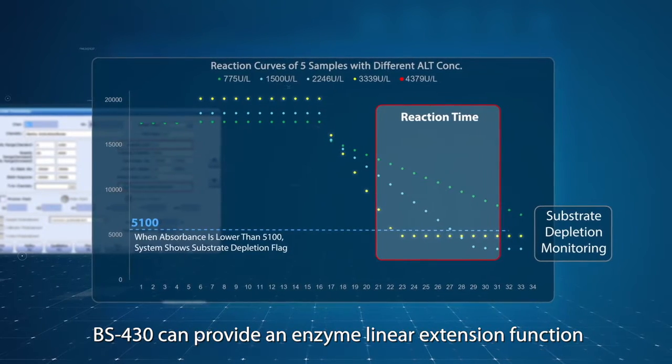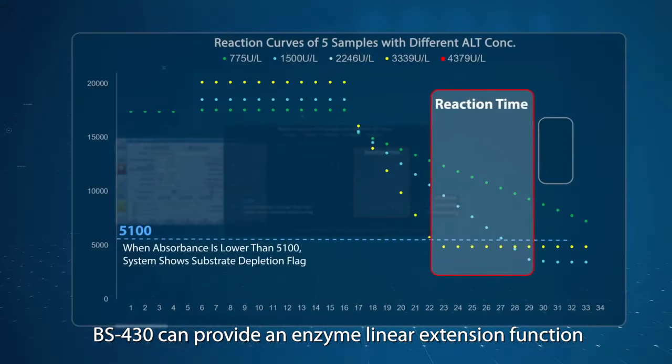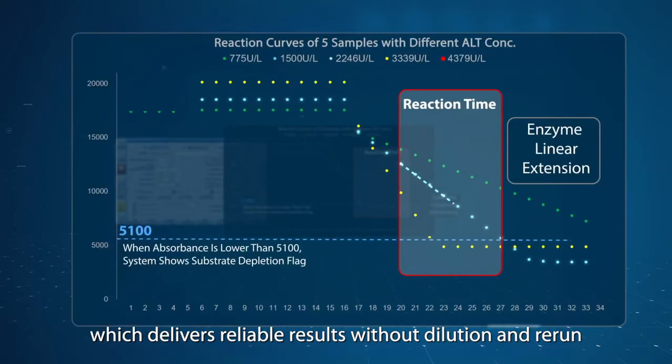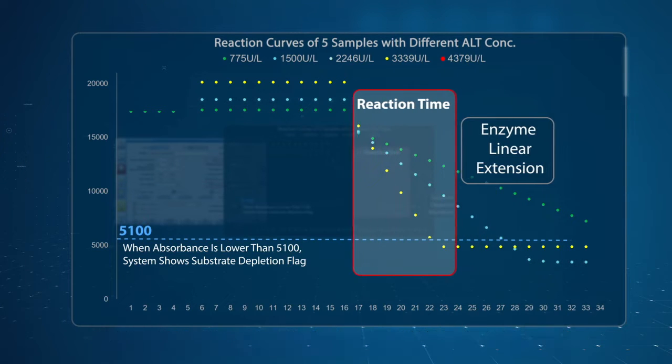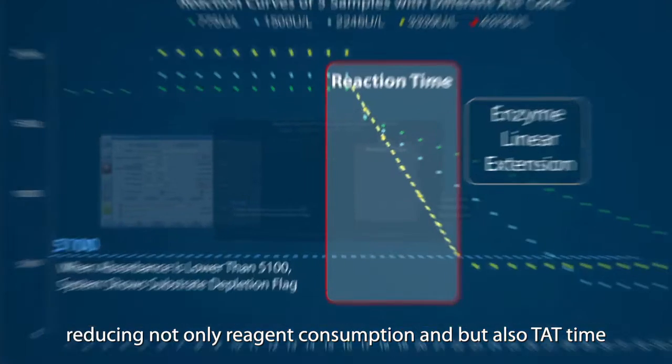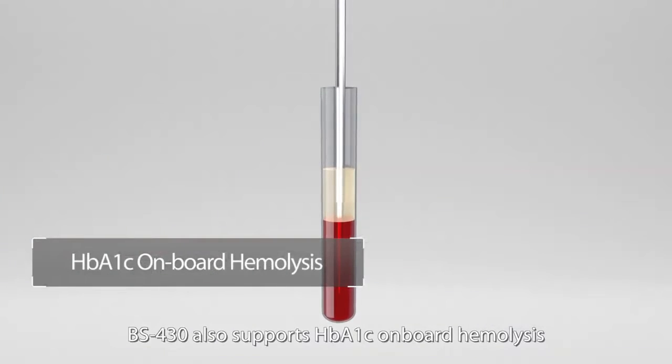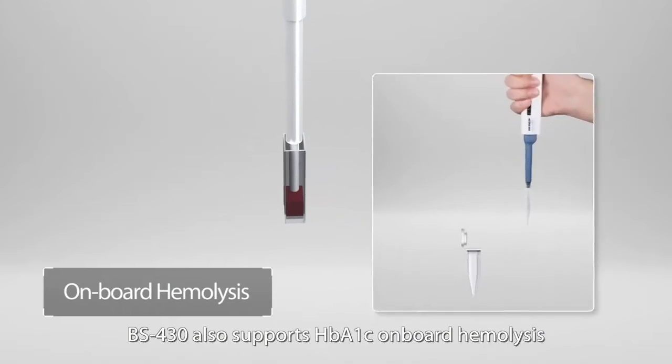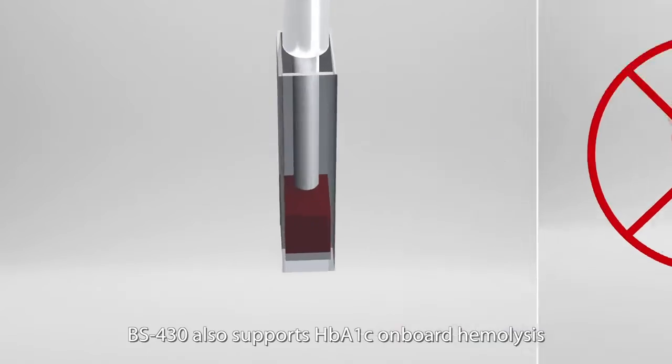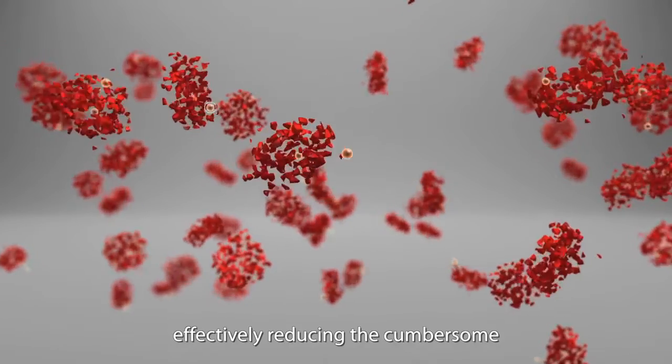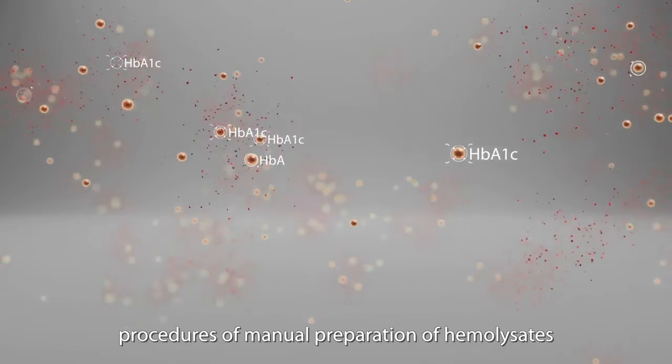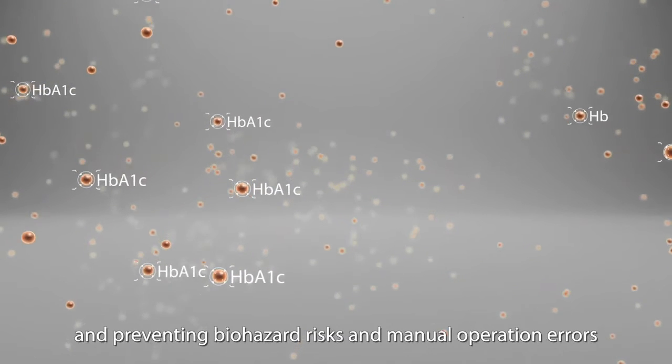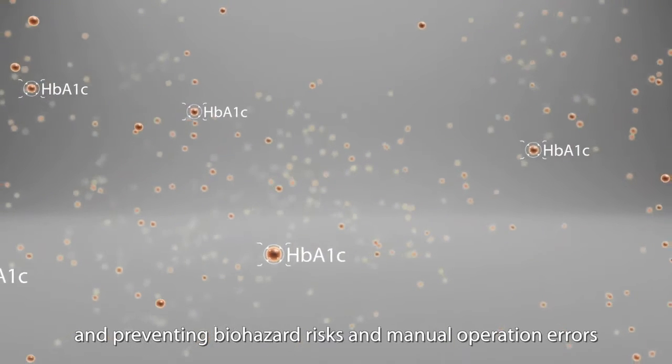Moreover, BS430 can provide an enzyme linear extension function which delivers reliable results without dilution and rerun, reducing not only reagent consumption but also TAT time. BS430 also supports HBA1C onboard hemolysis, effectively reducing the cumbersome procedures of manual preparation of hemolysates and preventing biohazard risks and manual operation errors.